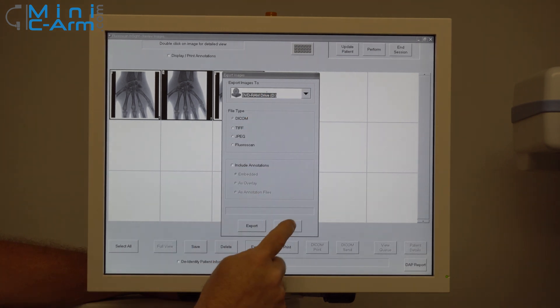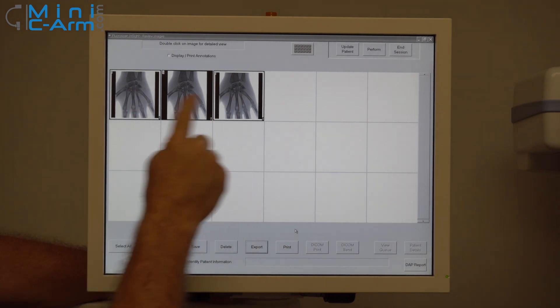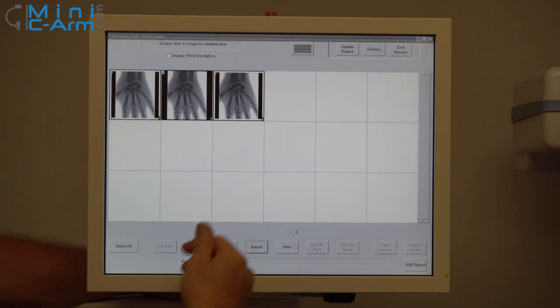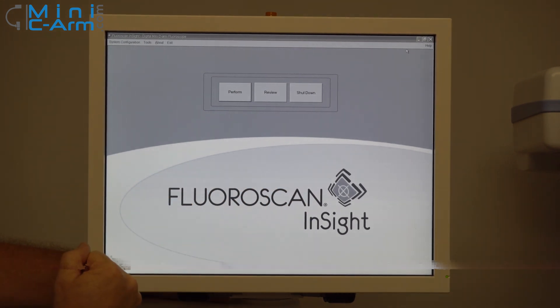We're just going to hit cancel here. You can also print — as long as you have at least one of these images highlighted, you can print. And then once you're finished with that, you can hit end session and you're back out to your splash screen.